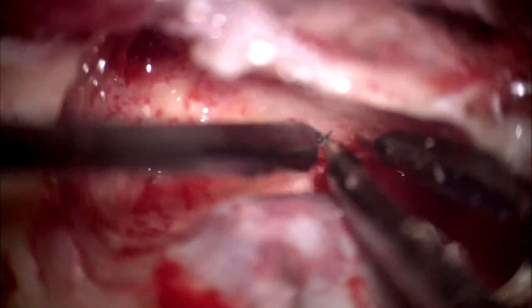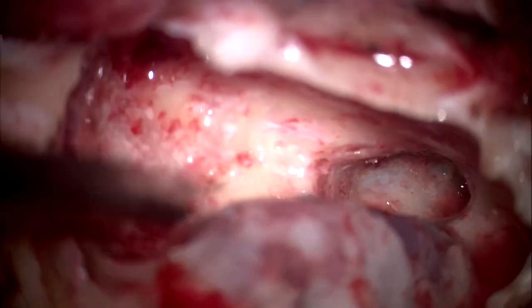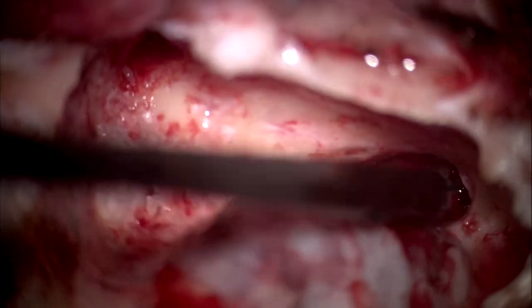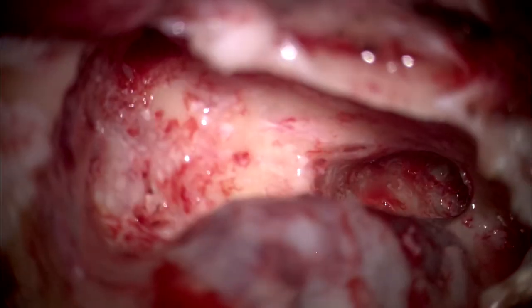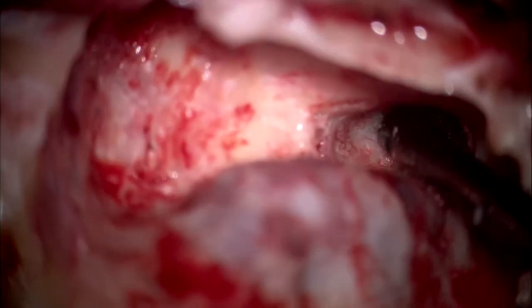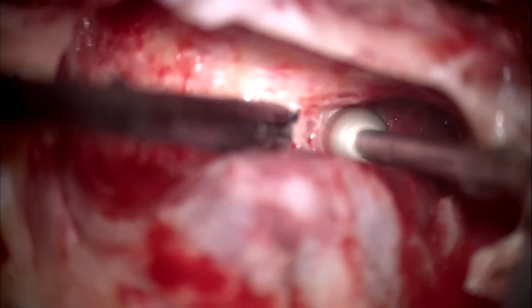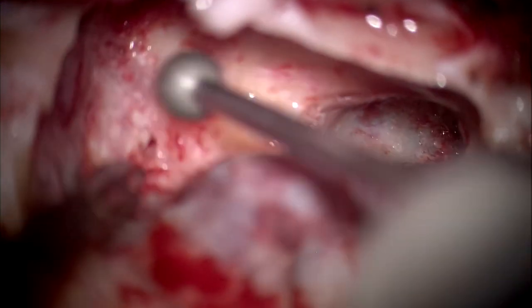See, this is just a little bit of the perifacial ooze, see this? No, diamond again. So that is the jugular bulb. Below, this is the jugular bulb, yes. This bluish. See again. See that? I hope it is clear? Yes, sir. Very, very clear now.